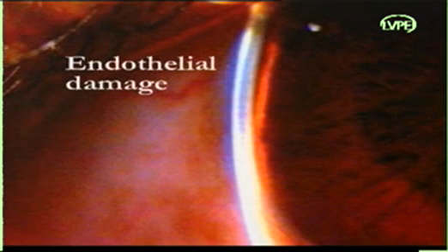As media opacity and induced astigmatism can degrade an otherwise predictable optical breakdown, try to avoid corneal scars and arcus senilis. Also, make sure that you avoid distortion of the laser beam by aiming the beam perpendicular to the contact lens. Improper focusing will lead to swelling of the iris stroma, after which penetration will be impossible no matter how much one may increase the energy. Since the shock wave propagates towards the surgeon, endothelial damage can occur when the chamber is very shallow.